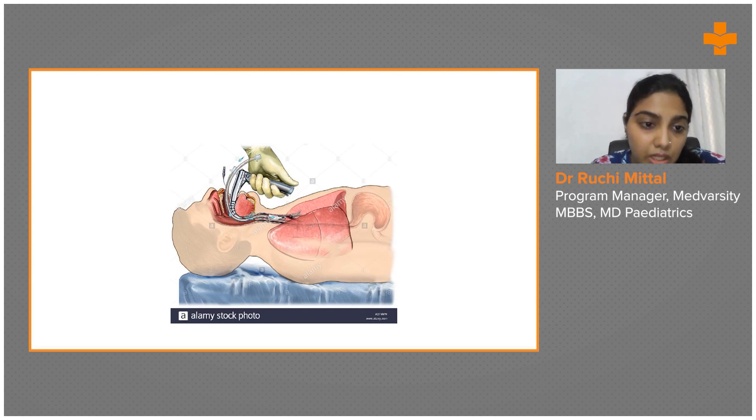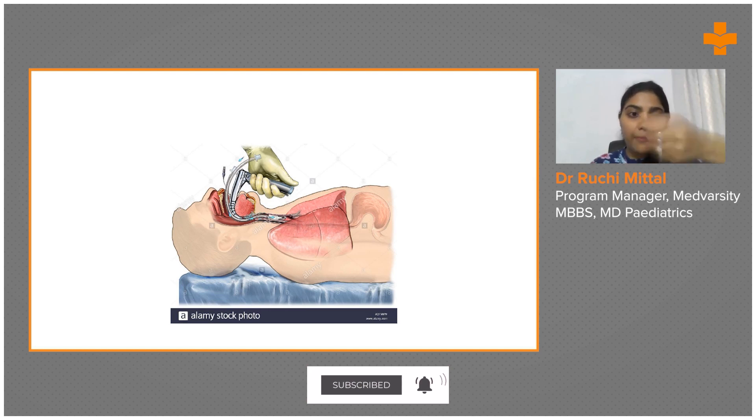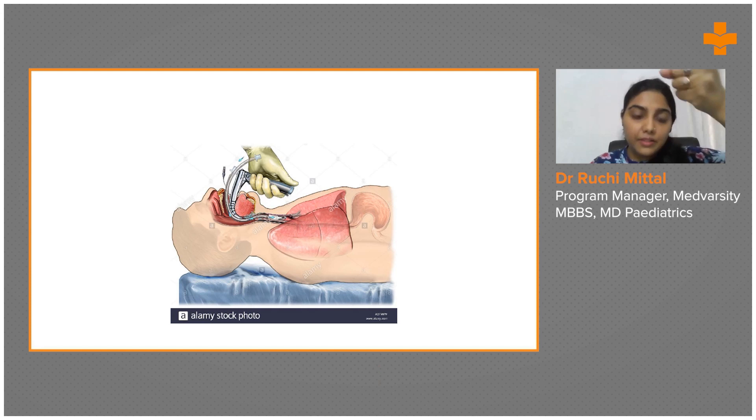When you insert the laryngoscope, you don't pull upward or go down — you apply pressure upward and forward, bringing the jaw up. Just insert the laryngoscope and pull it up. Make sure you don't damage the patient's teeth, tongue, or other structures.